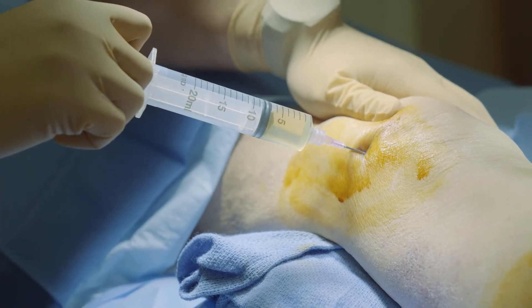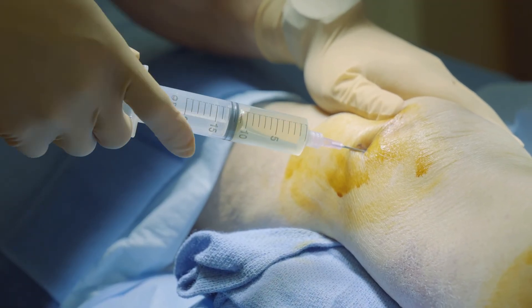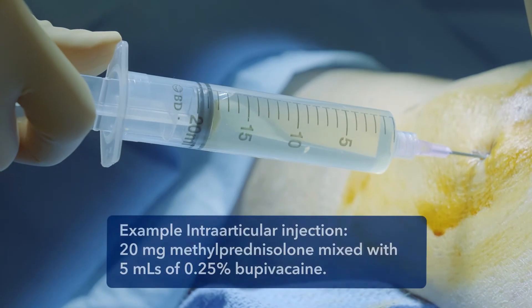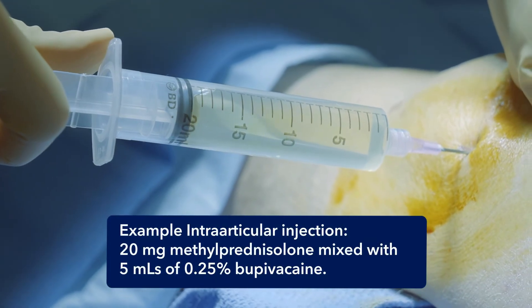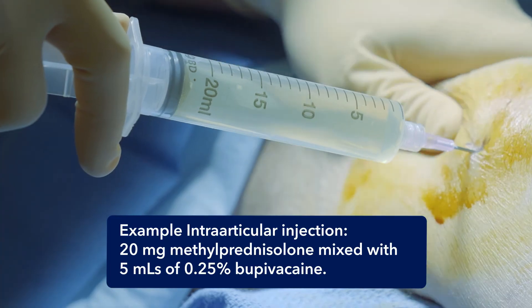If you are instilling anesthetic and/or steroid, replace your syringe after removing it with your knee aspirate. You may inject your anesthetic and/or steroid via a new syringe. Send the knee aspirate for analysis after putting a cap on it.